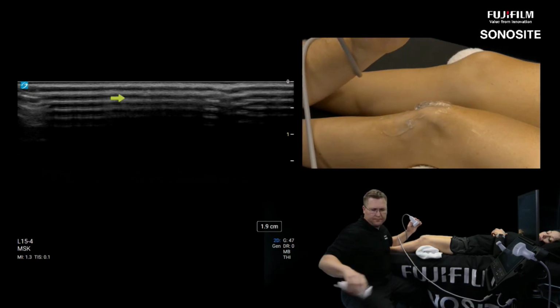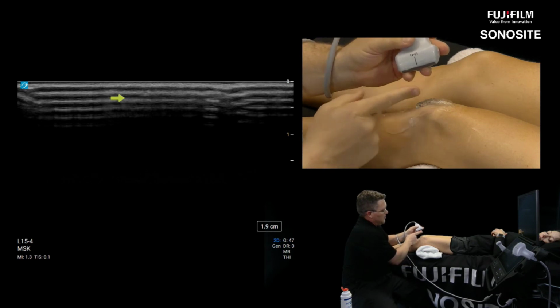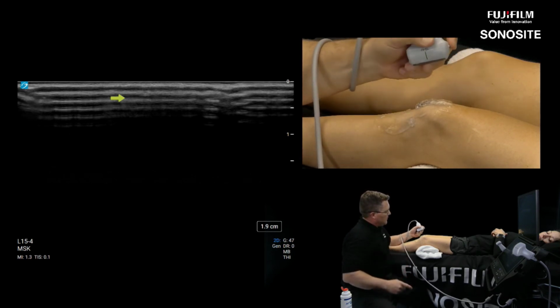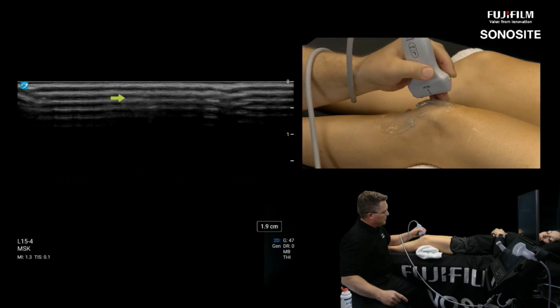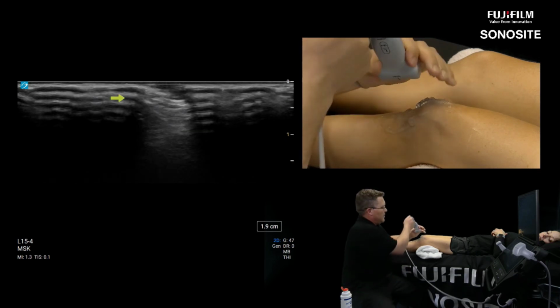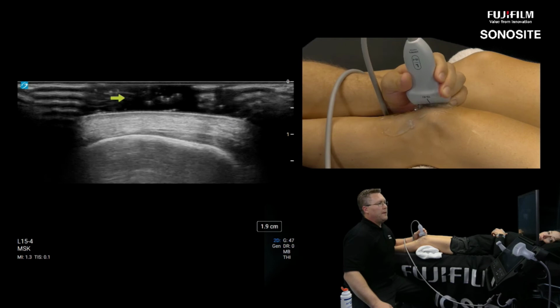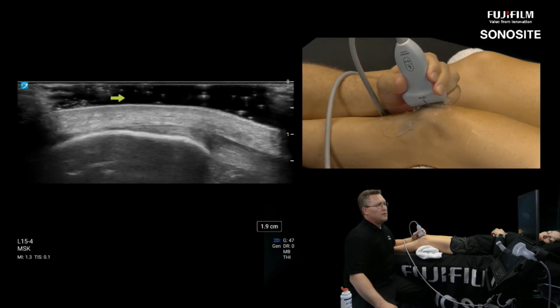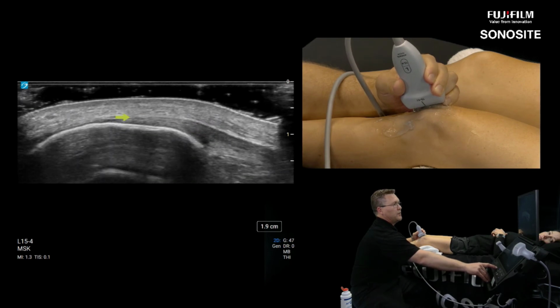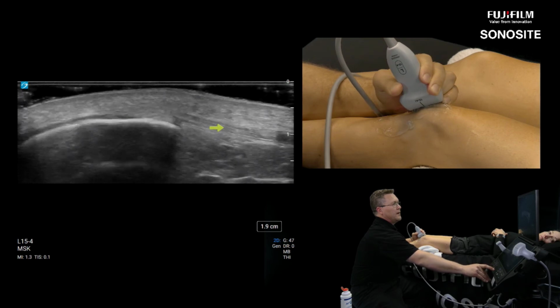just like that. And then I'm going to do the same trick where I'm hanging my fingers underneath the transducer like this. When I hang my fingers underneath the transducer, I'm not collapsing the prepatellar bursa, and I have a lot of scanning stability. I'm trying to keep the cord out of the camera view. I have a lot of scanning stability without squishing the subcutaneous layer. So here's where I would be looking for that prepatellar bursitis to live, okay?